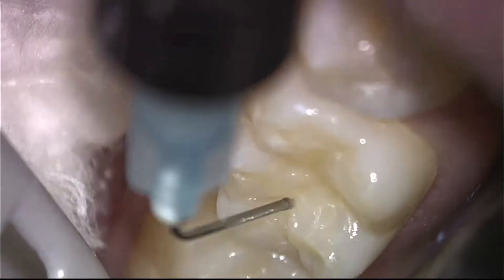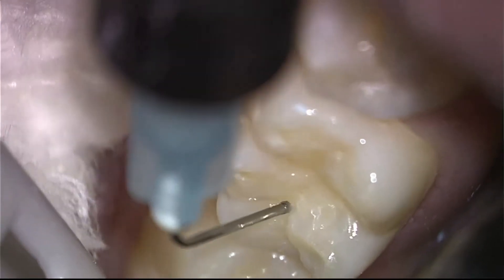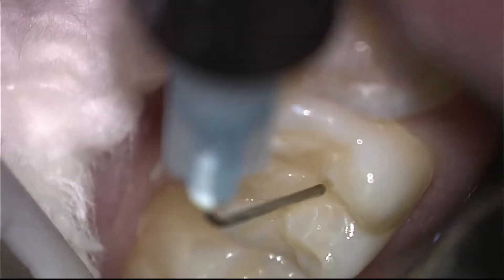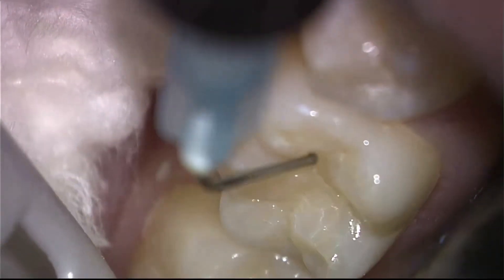Here is the placement of the permanent filling material into the grooves and pits of this tooth. It is a bonded composite resin in a flowable form.